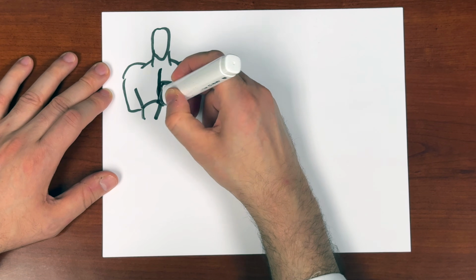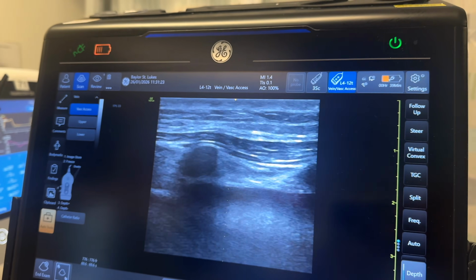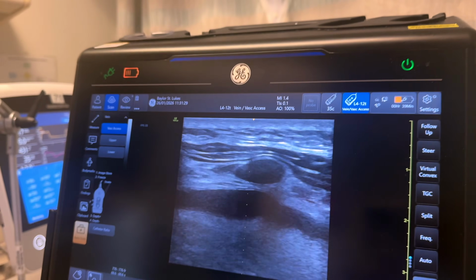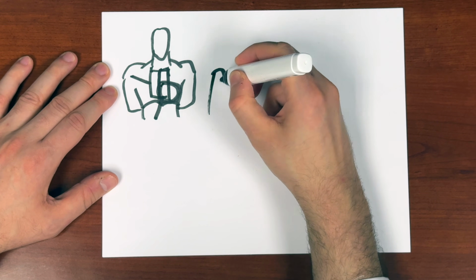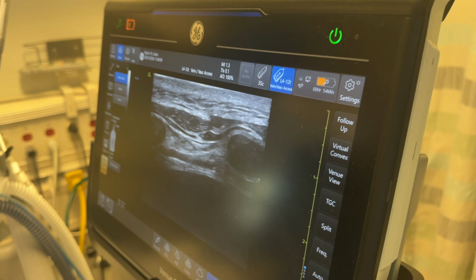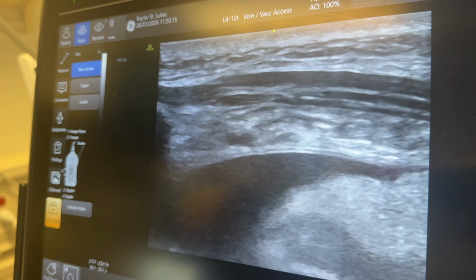I really believe that most of the time you can get a good view from the peristernal view. The peristernal approach means placing your linear transducer probe right next to the sternum, and then you look in between the interspace with ultrasound. You can actually see the pericardial fluid and then the heart beating below that. When you put your linear transducer probe right here on the chest, it'll look like two ribs that cast shadows. In between, you'll have the intervening interspace, and you actually find that pericardial fluid underneath, and you'll see the heart beneath. I found that it's much easier to find a good rim anteriorly right next to the sternum.